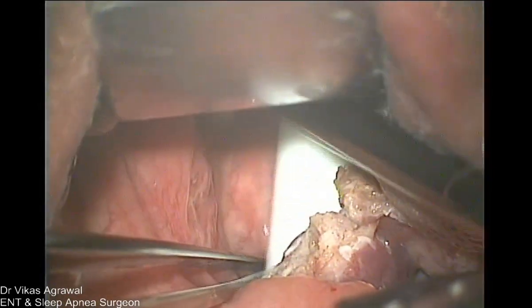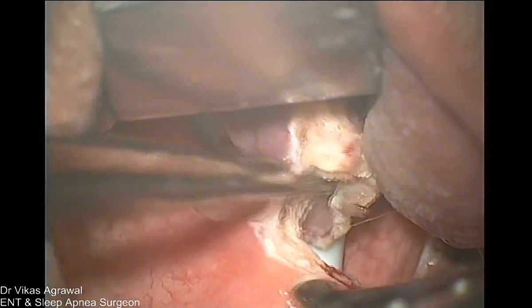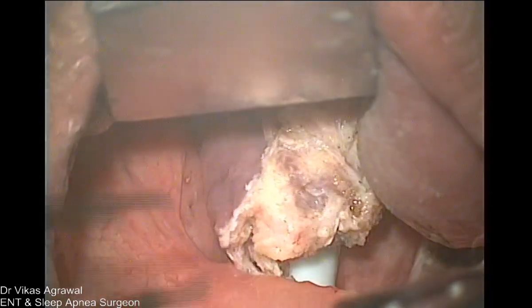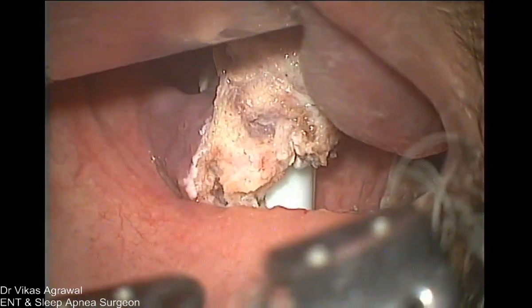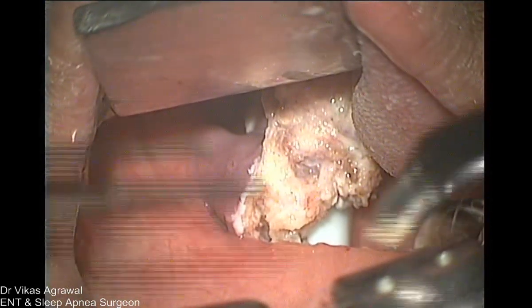Because the intubation is done from the left nostril, obviously the tube is closer to this side. Is it centralized and in focus? Excellent. Focus a little bit, please.